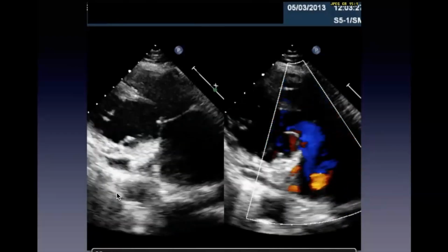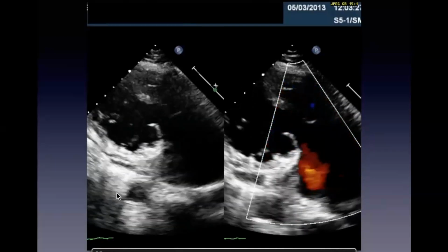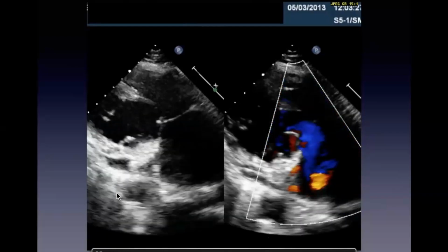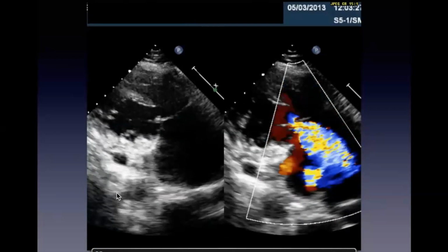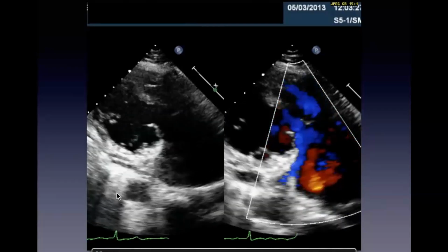If there is a shunt of some sort, you might have a left to right shunting of some sort. Yeah. And we saw that on the short axis actually. It's fairly continuous actually. So it could be IVC flow, although it's a little bit off that. So yeah, you'll see it on the short axis. I agree with you, Joshua.